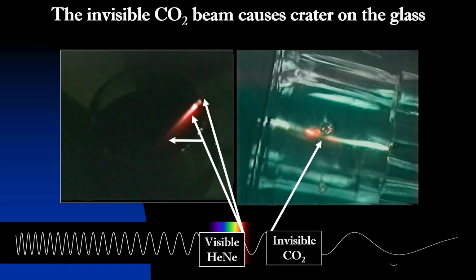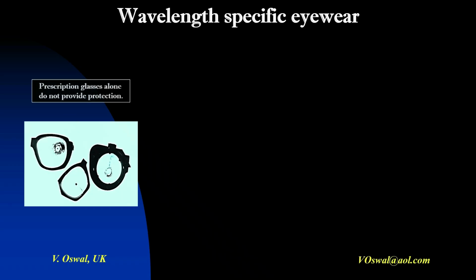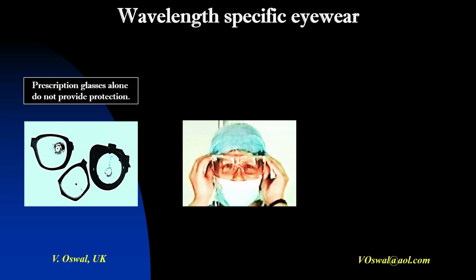The glass shattered into several small pieces due to microfractures. This experiment shows that prescription glasses made of silica do not protect against the CO2 laser exposure. Specialized eyewear is necessary to block the specific wavelength.